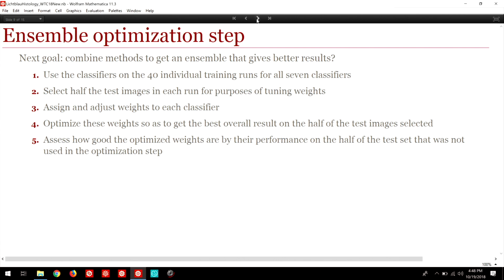The SVM and logistic regression did the best. The neural net was also somewhere in the middle, although we did the most naive thing possible, Method goes to neural net, with no performance goal or tuning for quality or speed. We didn't try to get fancy with the neural net. If we had, we probably could have made it do somewhat better.